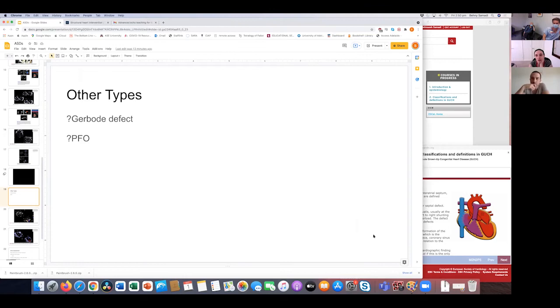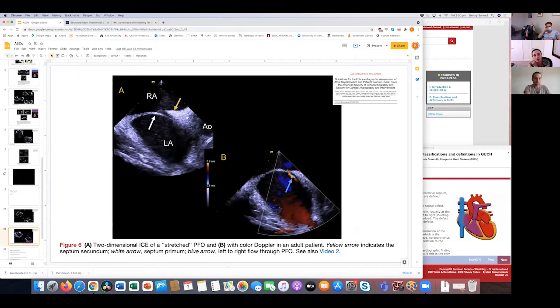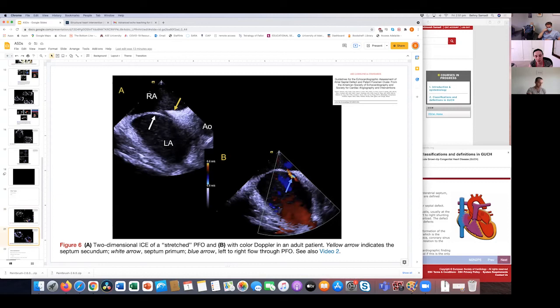Here we have a patent foramen ovale on TOE, showing that flap - which is essential to visualize when assessing for a PFO. You want to get this part of the septum, and you can see nice color going through showing it's still patent. This example shows a stretched PFO - the flap has been stretched out, which can look like a secundum ASD, but the differentiating features discussed earlier help here.